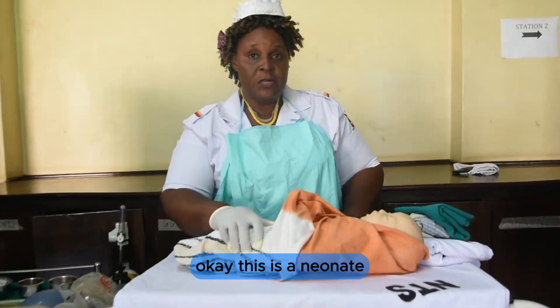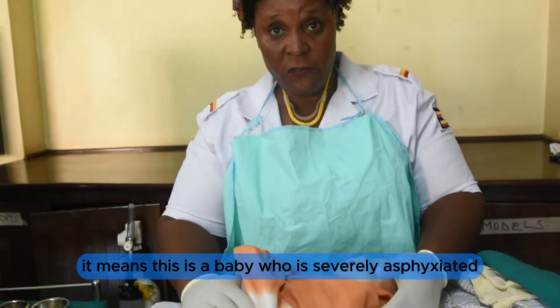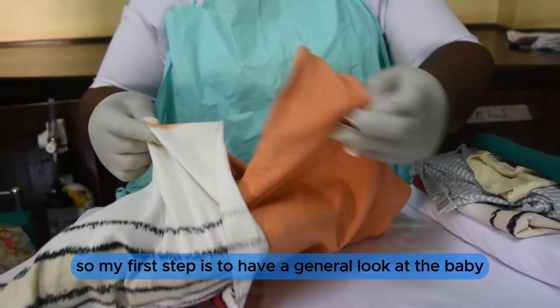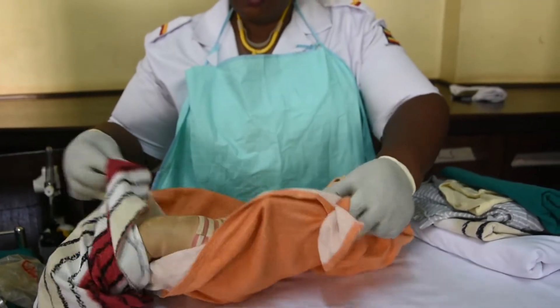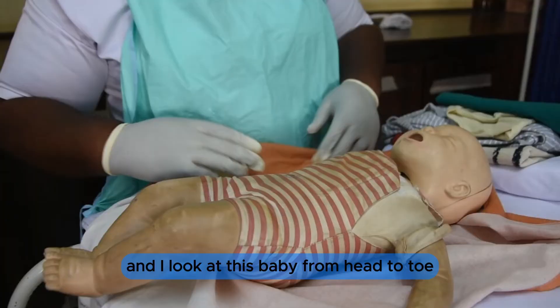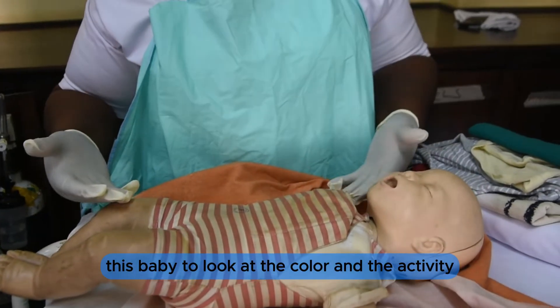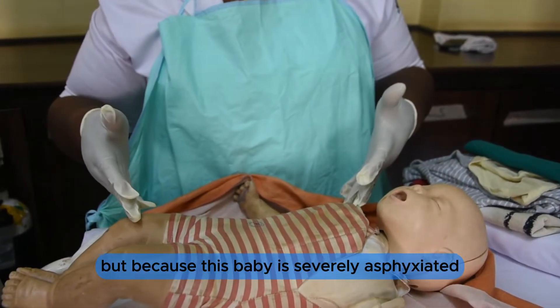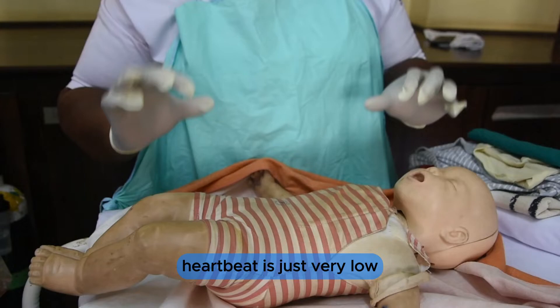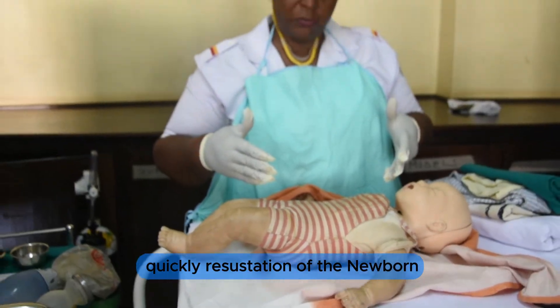This is a neonate I am going to resuscitate with an Apgar score of 3, which means this baby is severely asphyxiated. My first step is to have a general look at the baby from head to toe, assessing color and activity. Because this baby is severely asphyxiated, the color may be blue, respirations are not present, and heartbeat is very low, so I am going to carry out quick resuscitation of the newborn.